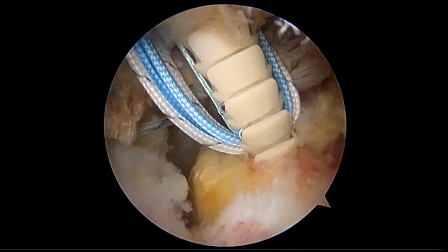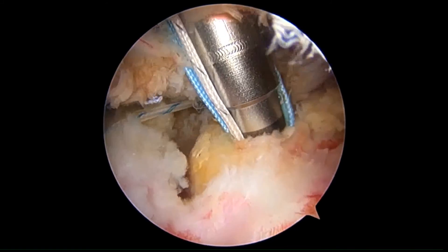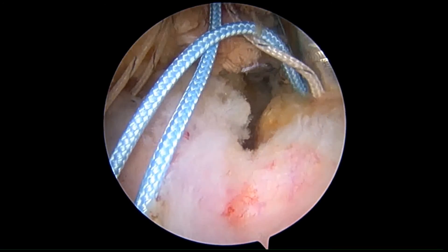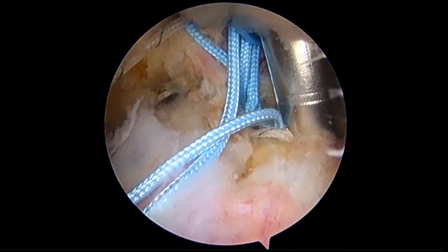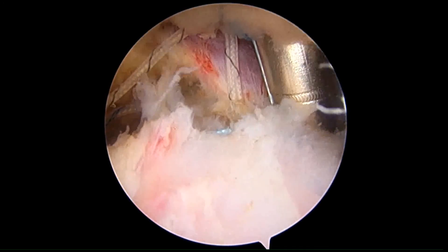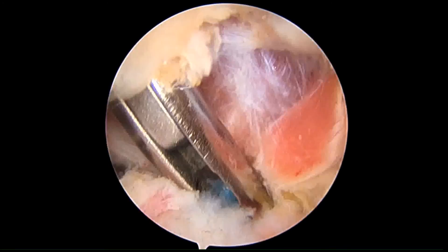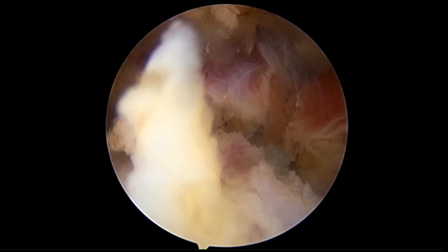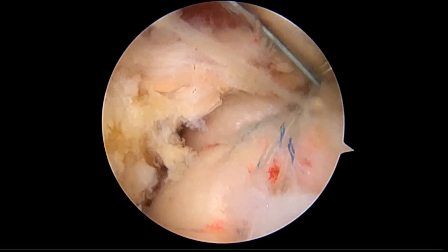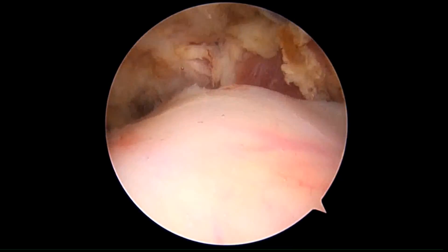This is an example of a footprint anchor. We pass the sutures into the anchor and we're now tapping the anchor into the bone. Once we've tapped the anchor firmly into the bone, we can now pull the sutures one at a time, snug it all up, so we can see the tendon firmly attached to the bone. We perform this several times, removing the sutures from the anchor, then repeat it again for all the remaining sutures — placing them through the anchor, tightening it up, snugging up, locking it in. Now we can see we've firmly attached the tendon back to the bone.